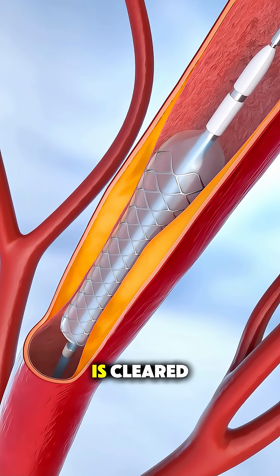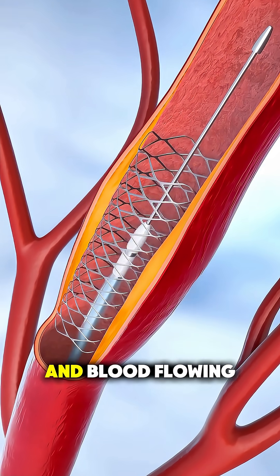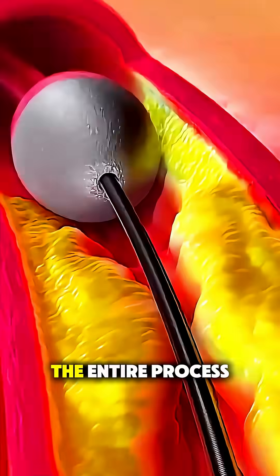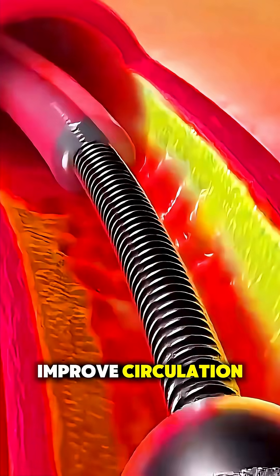Once the blockage is cleared, doctors may inflate a balloon or place a stent to keep the artery open and blood flowing freely. The entire process is minimally invasive and can dramatically improve circulation.